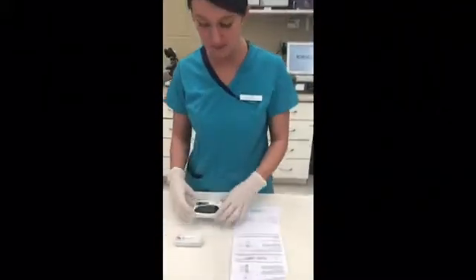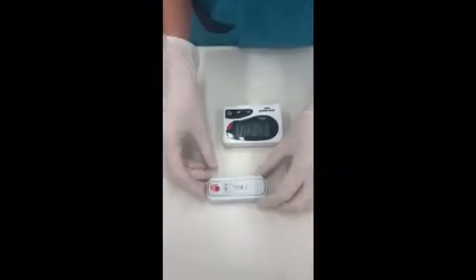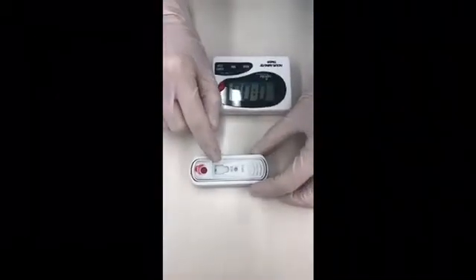Okay, so now that the timer is up, we're going to go ahead and take a look at our results here. This is the control dot, as you can see according to the manufacturer's instructions. The control dot is there, but none of the other dots have popped up, which means this patient is negative for the FIV, feline leukemia, and the heartworm.